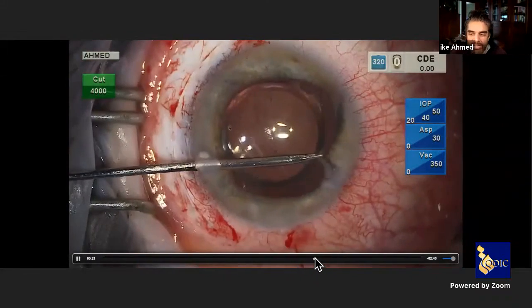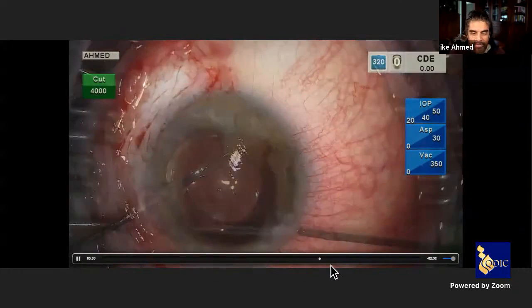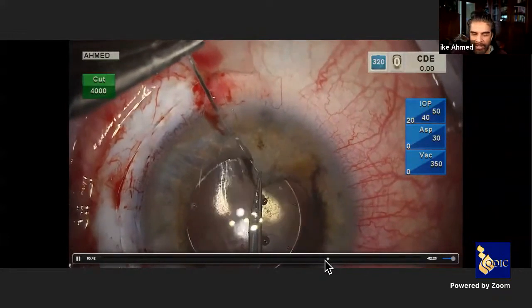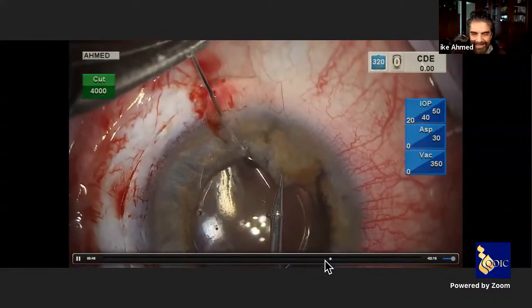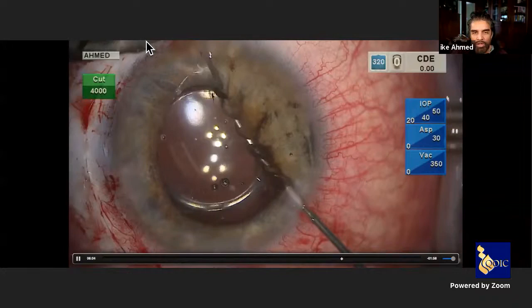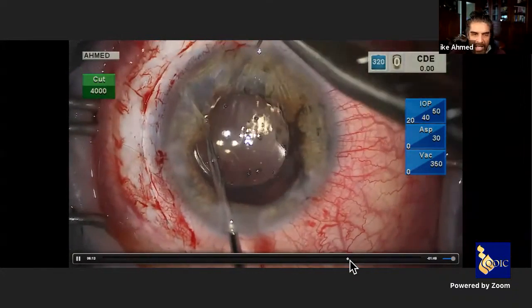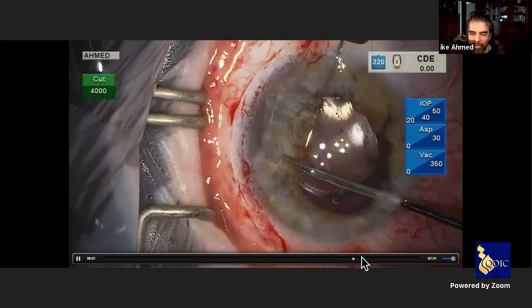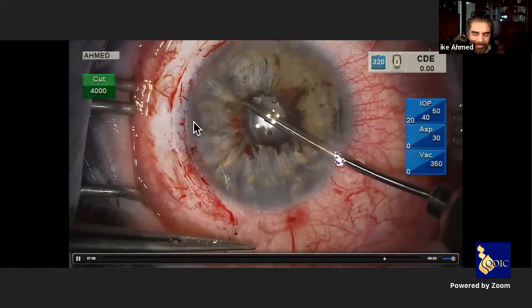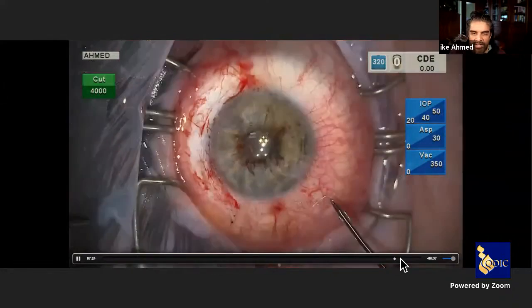The iris is looking better after the dialysis repair, but don't stop — the pupil is still atonic and dilated. We must repair the pupil as well. Using a CIF-4 needle, we perform a running cerclage overlapping technique, bringing the iris to the needle in four passes across a quarter of the eye, going double-armed in both directions, going all the way around. We then use the McCannel approach to bring the suture into the eye and lock the knot when we are happy with the size. At the end we have a nice round pupil.